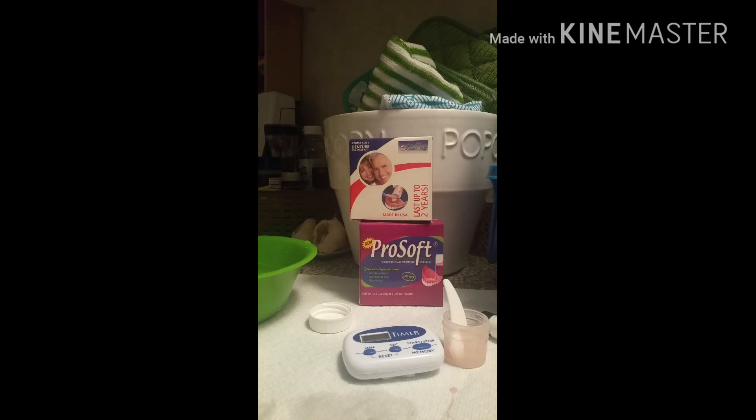That sounds fun! I'll leave a link to the Perma Laboratories website and their email for any questions I can't answer. I'm going to actually wear this for a couple of days and see how it goes.